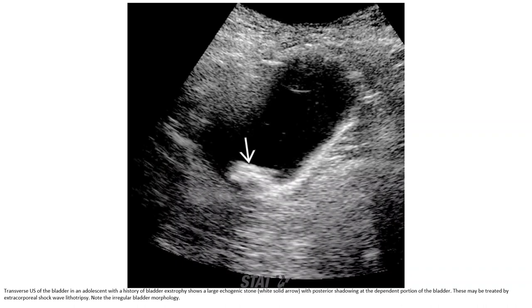This is an ultrasound of the bladder in an adolescent with a history of bladder exstrophy, showing a large echogenic stone with posterior shadowing at the dependent portion of the bladder. This may be treated by extracorporeal shock wave lithotripsy. Note the thickened bladder wall.